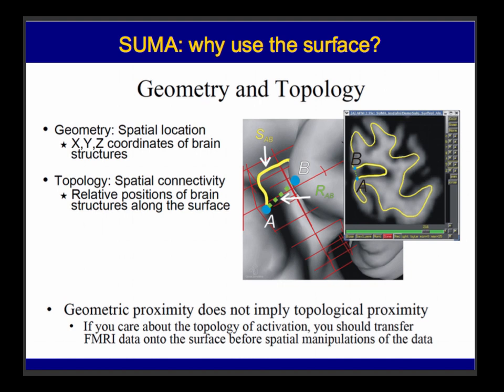And going back to the first case, if I asked you to move chairs, if you were holding hands and you move chairs with people without breaking your connections, you may be changing your geometry, but your topology would still be the same. So for example, a balloon, if I start with it uninflated, it has a geometry and a topology. As I inflate it, its geometry changes because the location of every point moves further away in space, but its topology is the same. The little neighborhoods around each little bit of plastic are the same neighborhoods, so it's topologically the same.